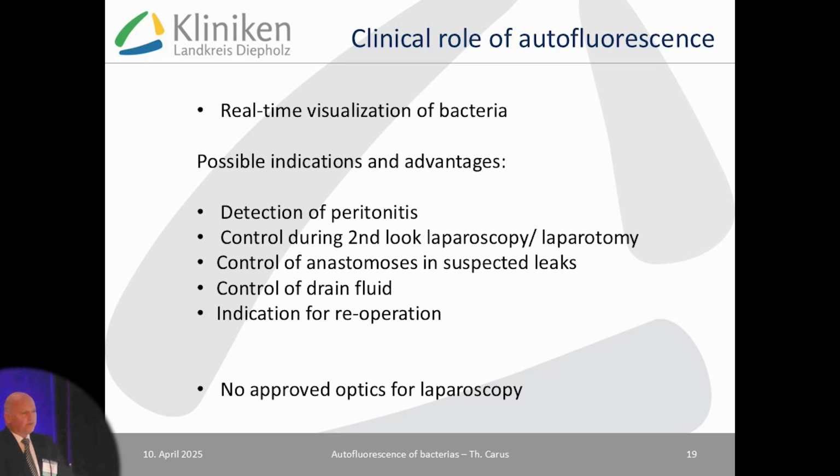The only problem is that up to now we don't have any optics that are approved for laparoscopy, but we hope that the industry will help us to build such an optic, like we saw this in ICG. First with a filter, then inbuilt. I think it's not such a problem. And the light source is also no problem with 405 nanometers.